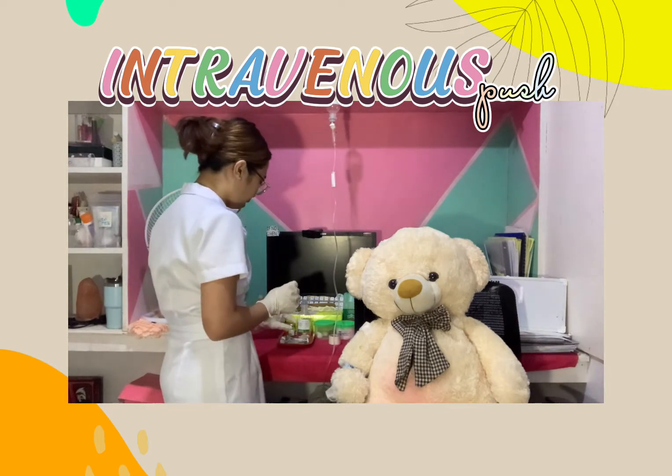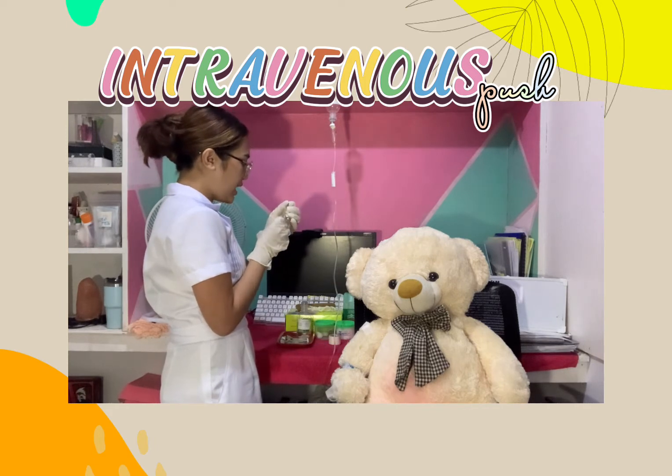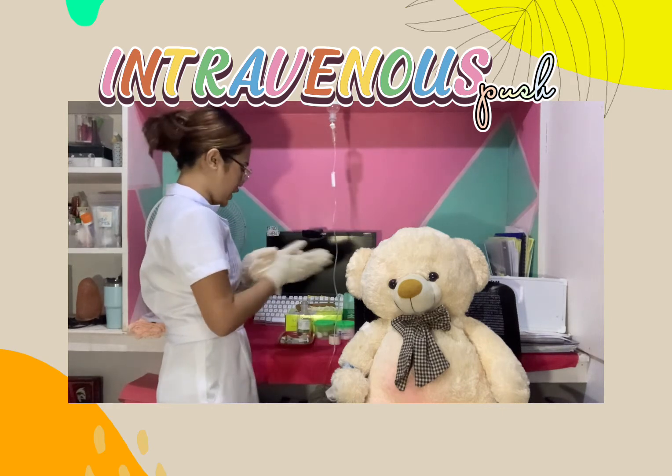We will prepare the ordered medication by first reading the label. Paracetamol, expiration date, January 1, 2022. There are no cracks on the bottle, there is no foreign body, and the clarity inside is in good condition. So, we will now withdraw the medication ordered.